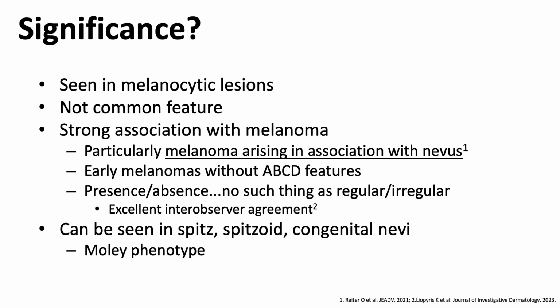And it's one of these features where it's either present or it's not present, which actually can make it a good thing because there's no regular or irregular appearance to it. When you see it, you know it's a positive finding, and that has helped, I think, with inter-observer agreement, meaning that we agree when we see the feature, whereas with some other features, defining when something is regular and irregular can be a little bit difficult.